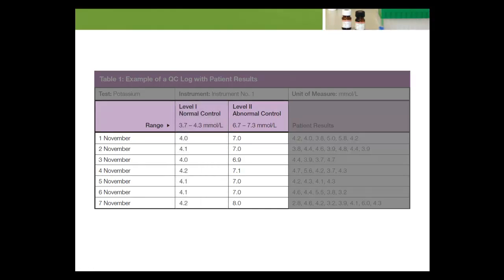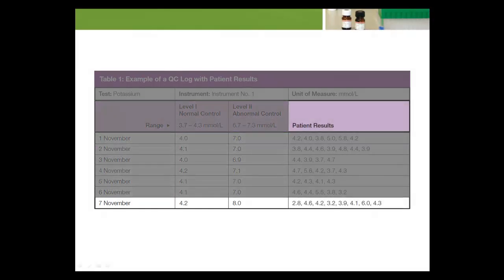On November 1st through November 6th, both controls were in control and patient values could be reliably reported. However, the laboratory was out of control for abnormal high potassiums on November 7th, because the QC value obtained was outside the acceptable range. This means that some error occurred which may have made some patient results unreliable. The laboratory should not report any patient samples with an abnormally high potassium result until the error is resolved and the abnormally high samples are retested.